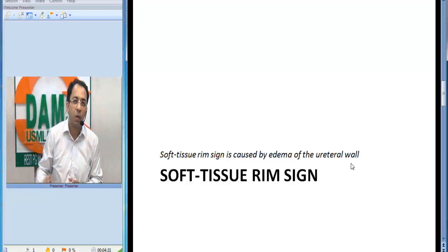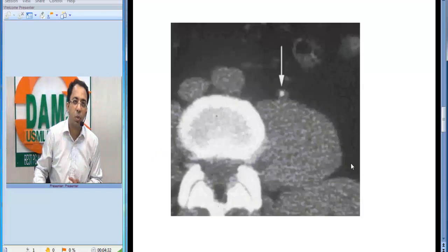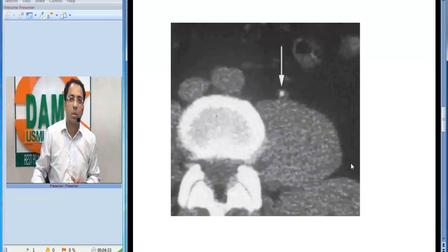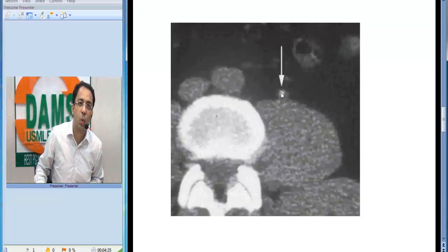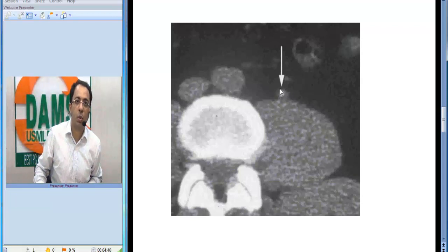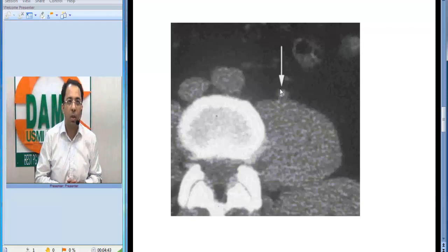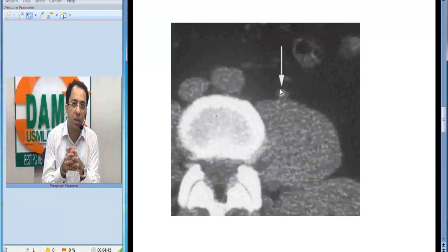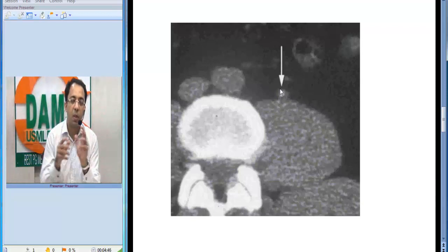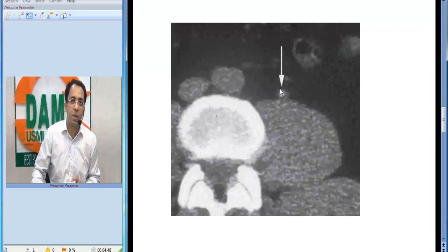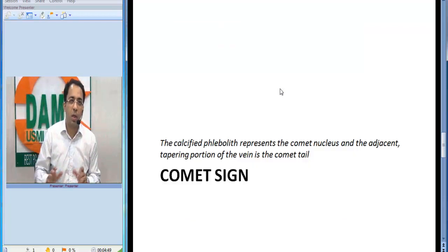Once you see a soft tissue rim, this is how it looks: this is a stone, and you can see soft tissue edema around the stone, which confirms the ureteric nature of the stone. This sign is called the soft tissue rim sign.